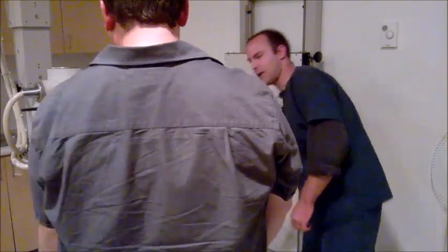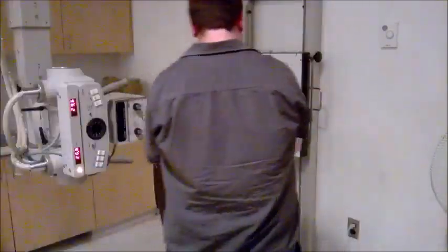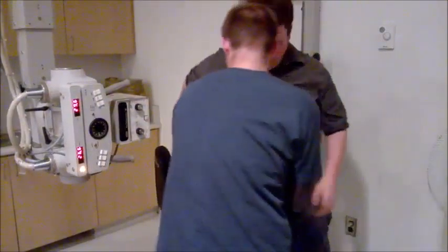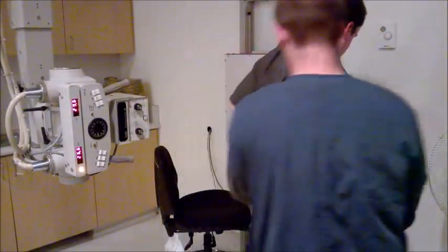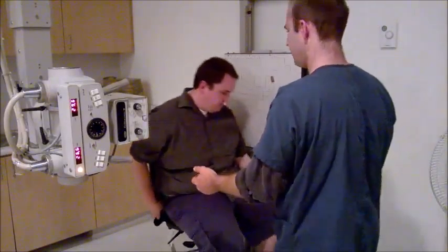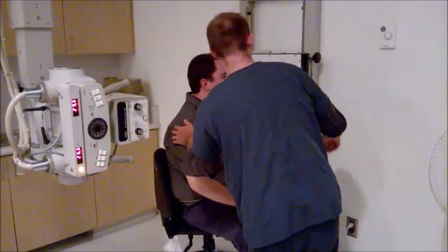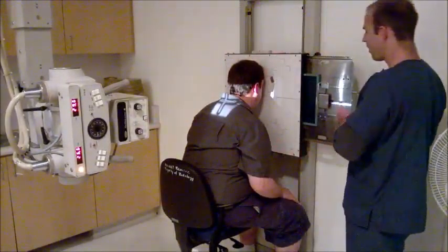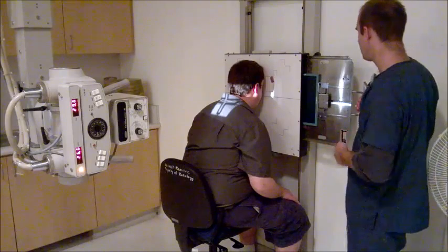So I need you to stand right here, and I'll get a lead on right here. Put it on backwards. There we go, sir. All right, sit down right there. See, forehead against the board. There. So I have my IR in. It's an 8 by 10 lengthwise.